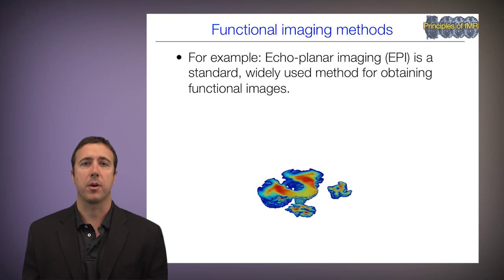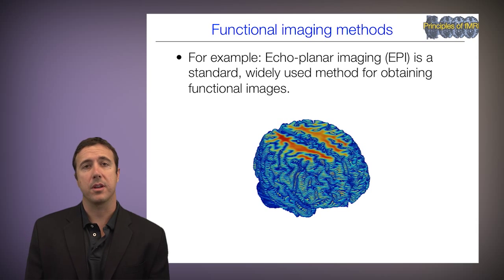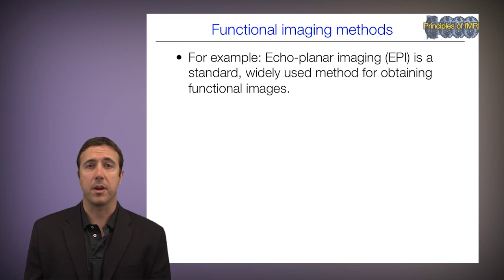The goal of this module is to review acquisition parameters and discuss some of the trade-offs involved so that you can make smart choices for your study when possible. One example of a standard parameter setting or choice is which sequence to use. Echoplanar imaging is the most commonly used. It collects slice-by-slice data from the bottom to the top of the brain.